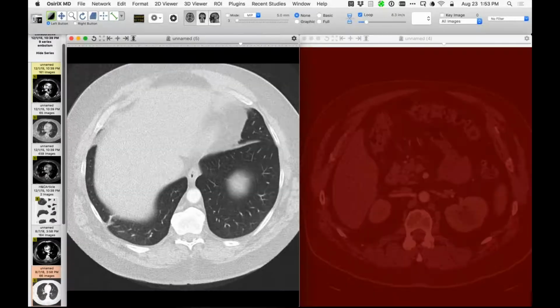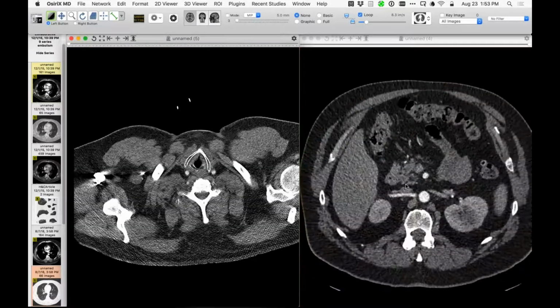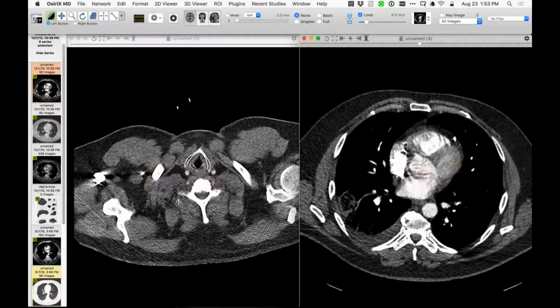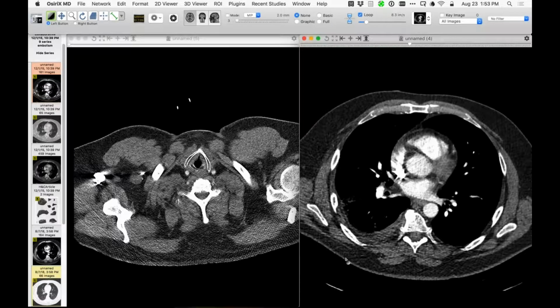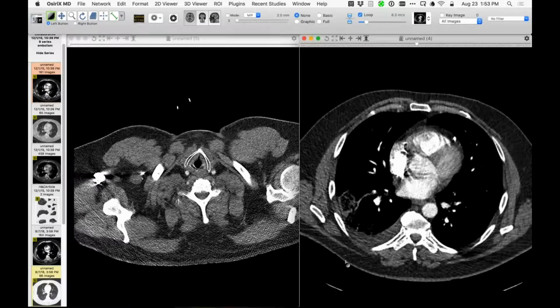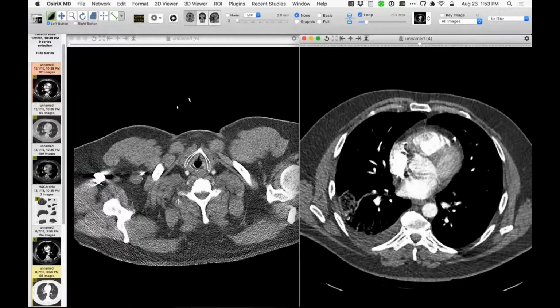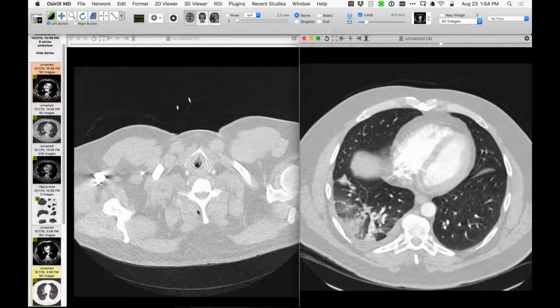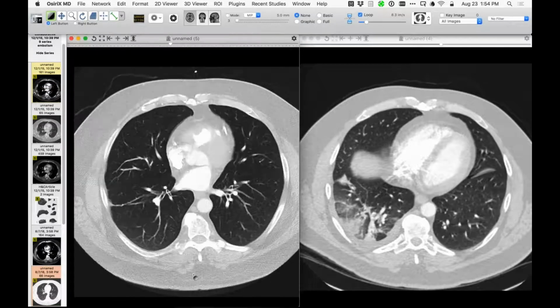And of course, if we go back in time, we see the genesis of that, which is an episode of pulmonary embolism. The time here is years, at which time he had these peripheral opacities, very typical of foci of pulmonary hemorrhage, a little bit of pleural fluid, pulmonary embolism. You can't predict to what extent you're going to develop an infarct in there. When we see this disordered aeration, we usually think there's an area that's eventually going to become a small collagenized infarct, but you don't really know. But this is what this person ended up with.